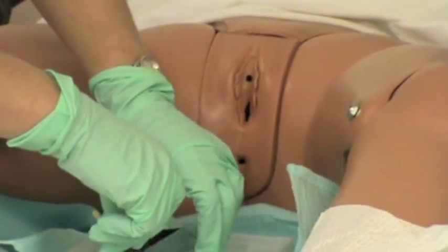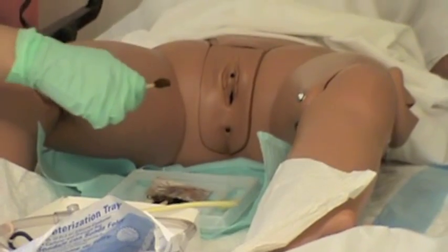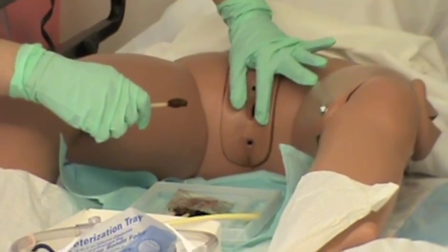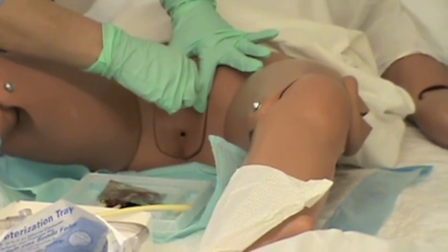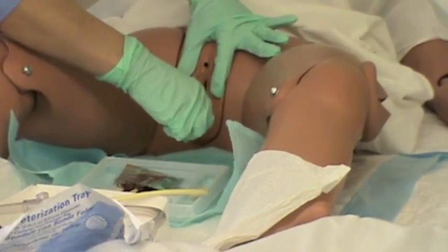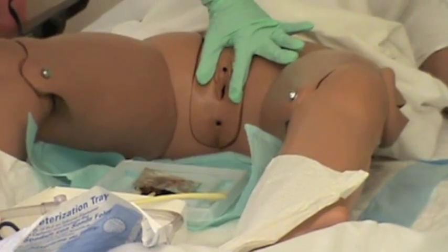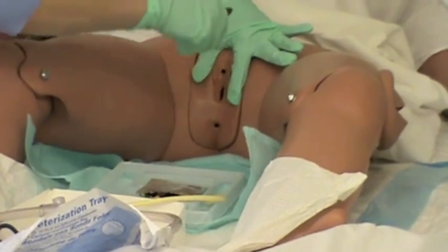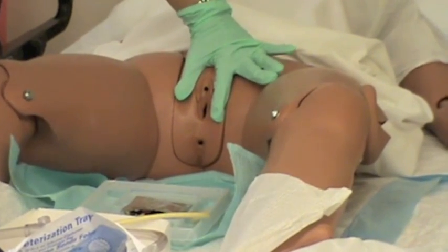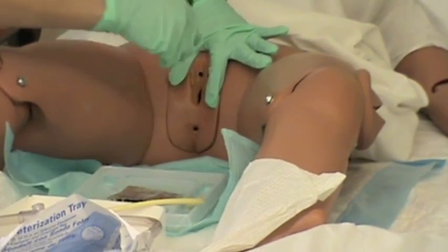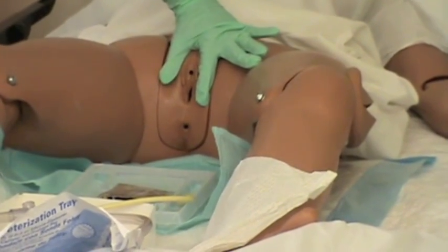I'm laying the catheter into the lubricant. Then I'm going to take my cleaning solutions. First I'm going to spread the labia and lift gently up. With the first swab I'm going to go to the far side, front to back and drop. The second swab to the side closest to me, front to back and drop. And the last swab right in the center, front to back and drop.